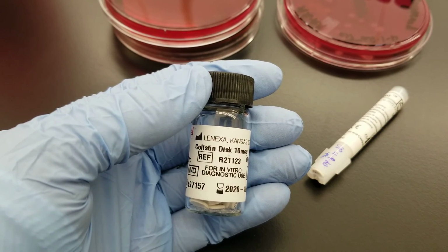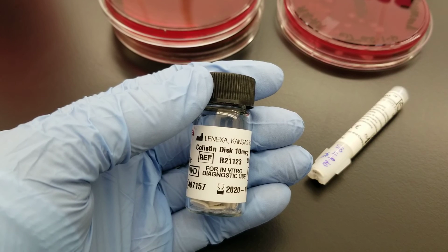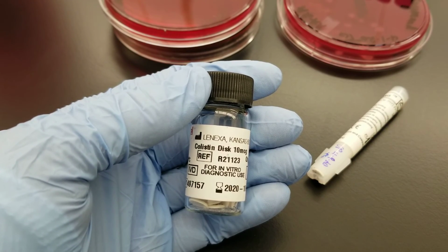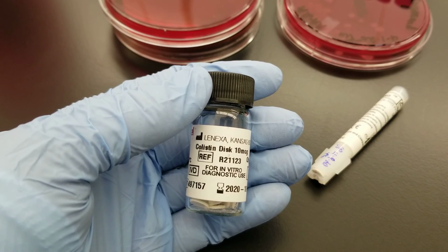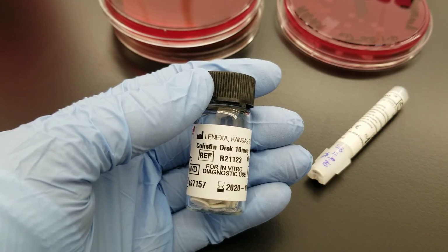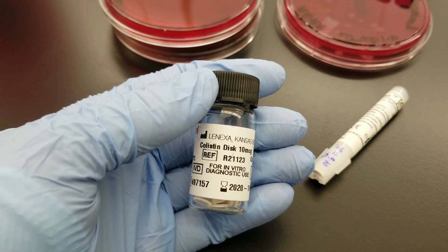An example would be if the therapy being provided to the patient is failing, and maybe that's due to an anaerobe that is very resistant to what is being provided. Then you might want to put that organism onto whatever automated analyzer you're using.